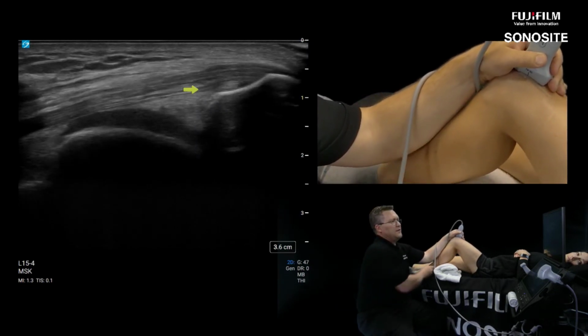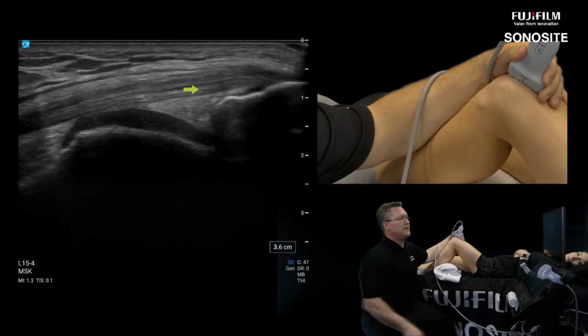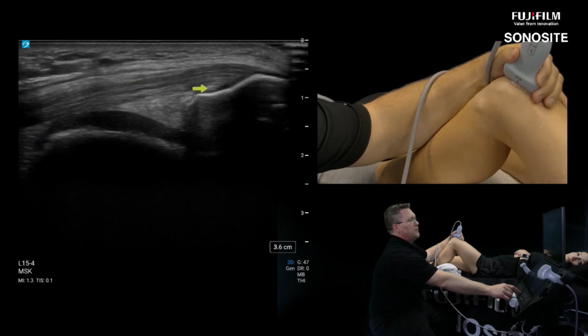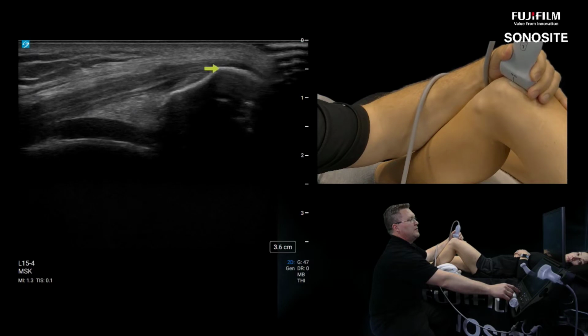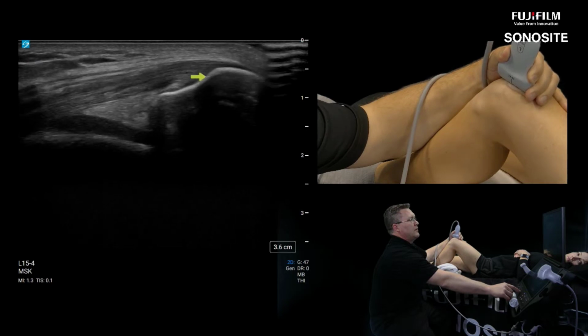And just like you saw on the slide, here we are. So we've got that tendon now in maximum tension, and that's going to help us identify any retractions in these layers. And then as mentioned, a lot of times on most people, you can notice these little facets on the patella, and they'll delineate, hey, this is rectus femoris. This is that blended layer here between the lateralis and medialis, and then the deep layer here would be intermedius.